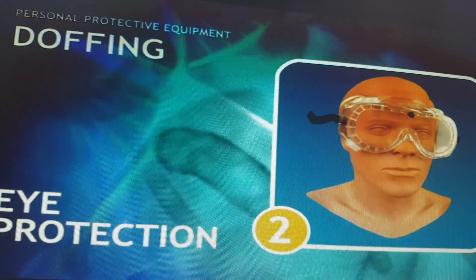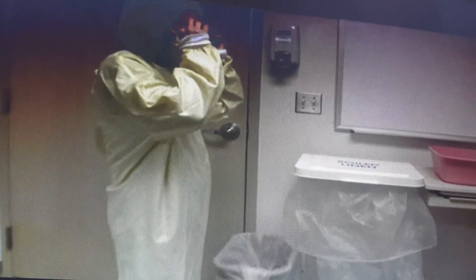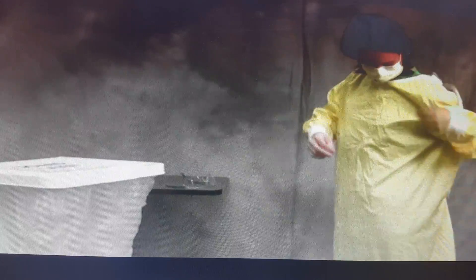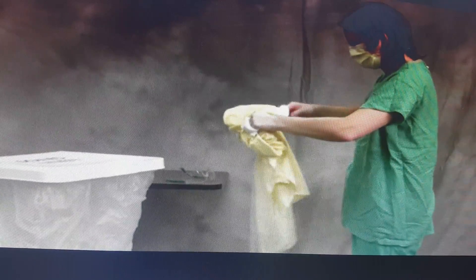The second item to remove is the eye protection — the eye goggles. Place them aside so they can be washed again if reusable. Then remove the gown: the outer surface of the gown is contaminated, so take care not to touch it. She removes the tie, rolls the gown so the outside faces inward, and discards it in the yellow waste bin.